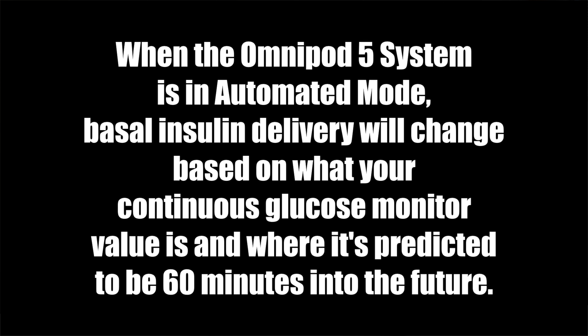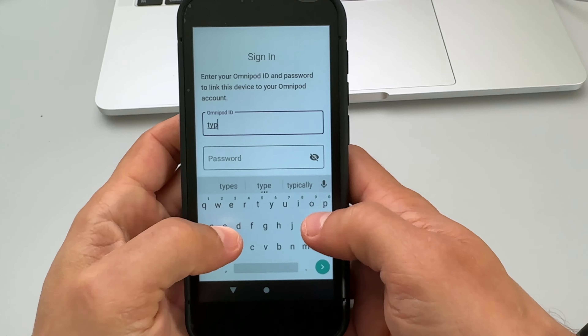I just got the Omnipod 5 starter kit sent to me and there is only one thing left to do — put the device on. I'm a little bit nervous because I've never used a tubeless insulin pump system, and I understand if you are too if you're putting this on for the first time. I'm going to try to take you through everything step by step.